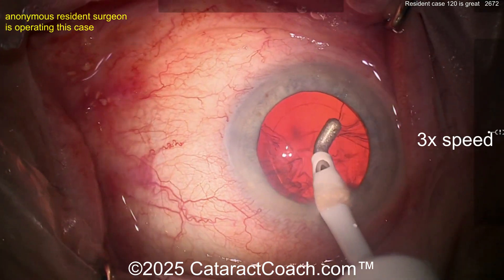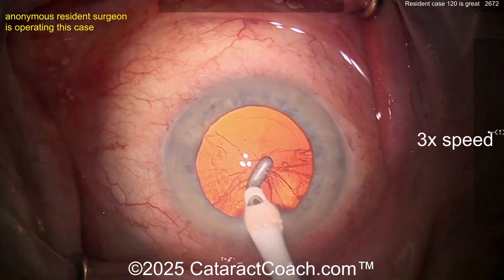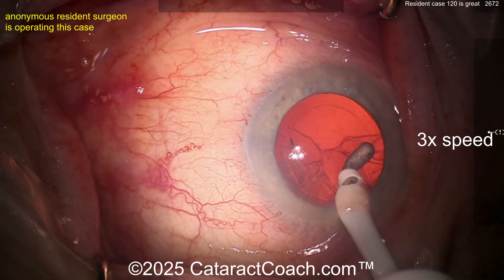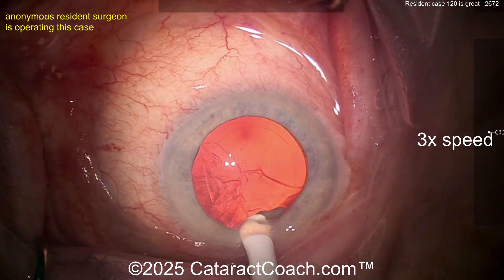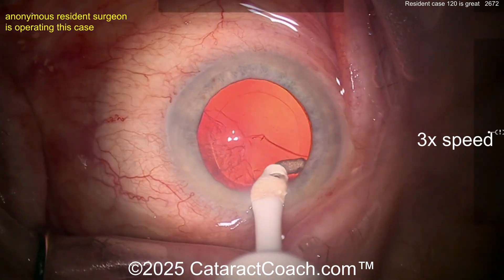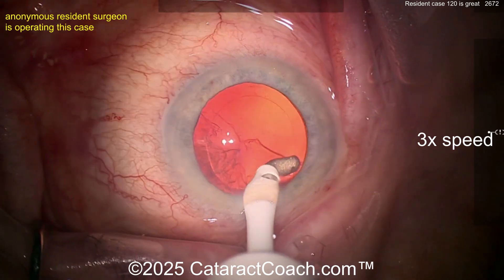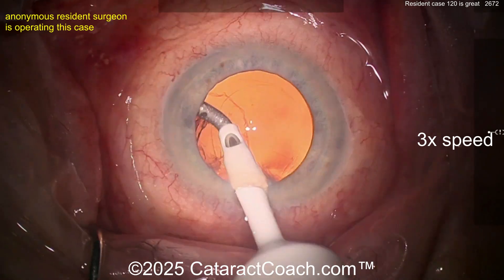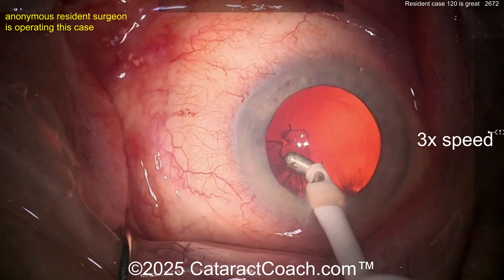Now cortex removal — nice technique, that looks good. Let's see how the sub-incisional is done — that's going to be the tricky one. Nicely just dissecting that off. You may want to do a little more hydrodissection next time; it may rotate the nucleus more and leave you with less cortex at the end. The extreme example would be the Rosatelli spin, which really removes a lot of cortex. Residents often like to use a bimanual approach, but in my videos I don't often use bimanual for cortex removal — I use the coaxial.